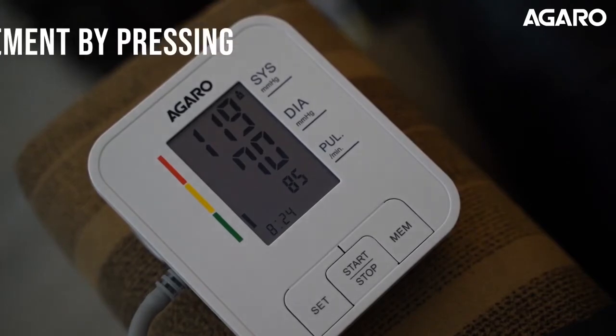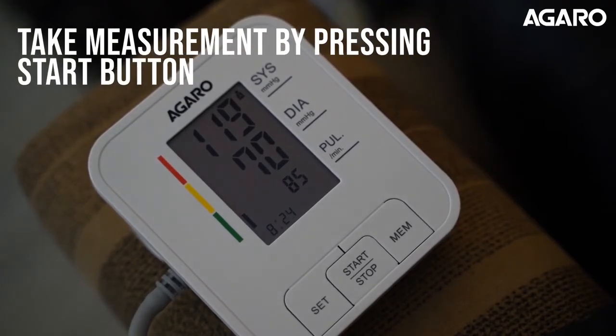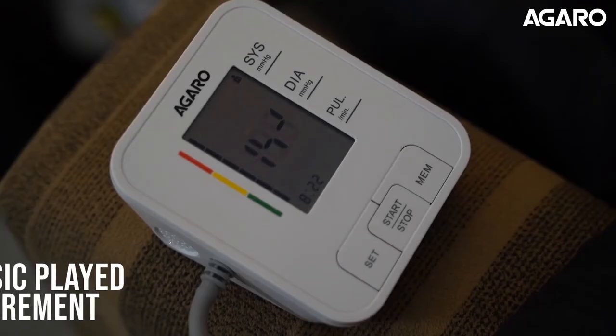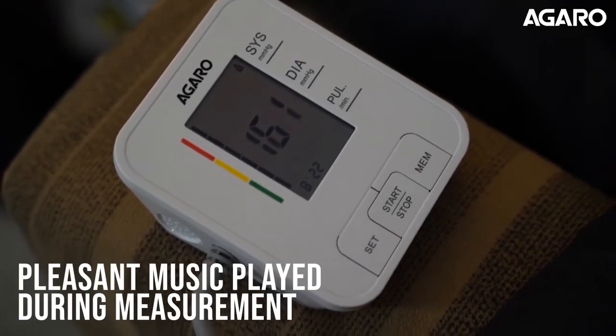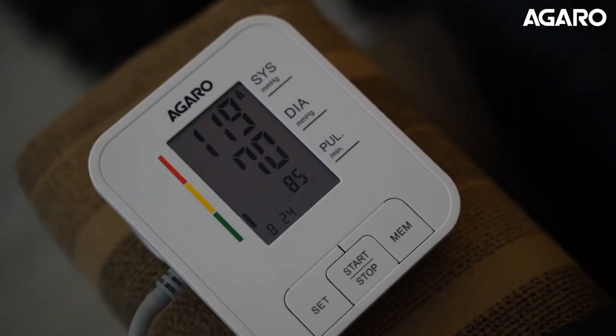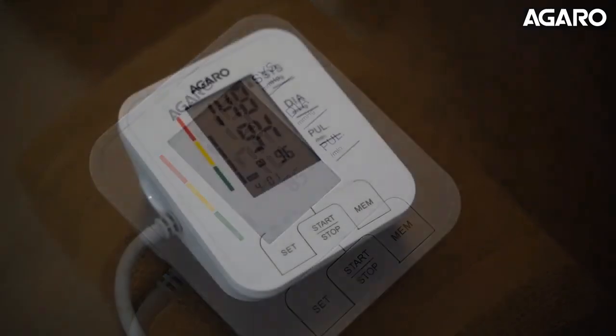To start the measurement, press the start button. The BP monitor starts the process of inflation and pleasant music is played while the operation is on. Once the pressure deflates automatically, the BP monitor gives out systolic and diastolic readings of your blood pressure on the LCD screen.